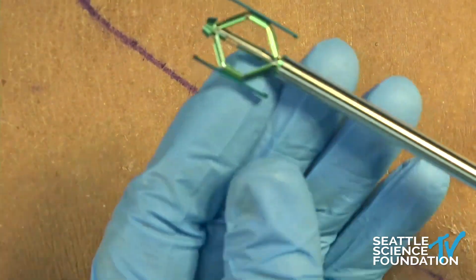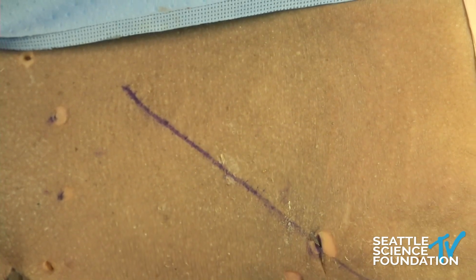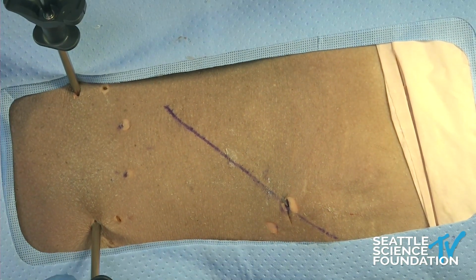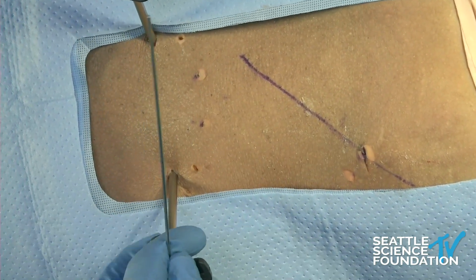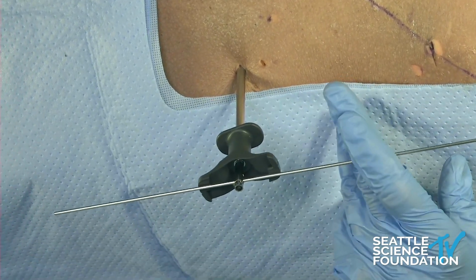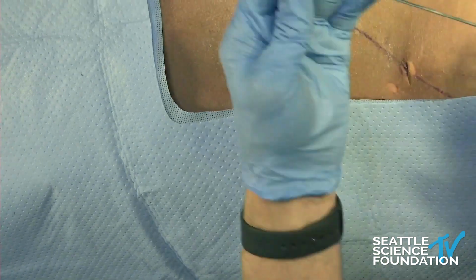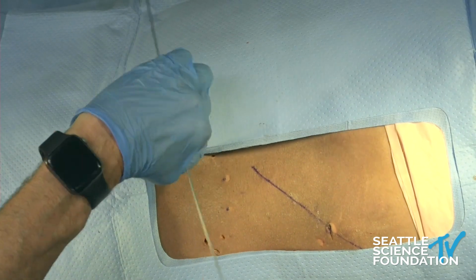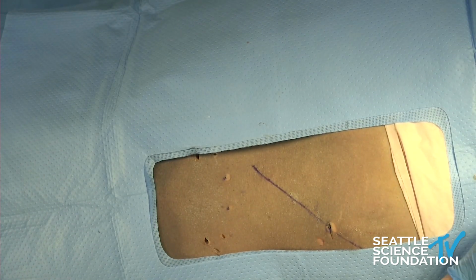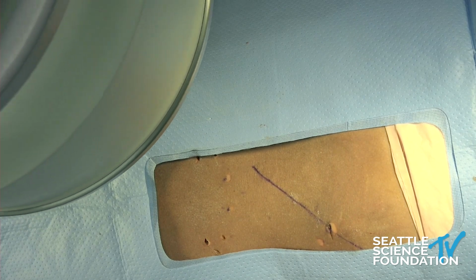And so this is set on here, and I'm going to show you how we pull this off in the patient. So we're going to take a K-wire and put it through the little holes in the working channel. Then I'm just going to twist and pull. Same thing on the other side. This disconnects the press fit, and the twisting motion is important. We'll separate that from the cement. And then that's it. Let's take a final AP shot here, just to see and admire our work.